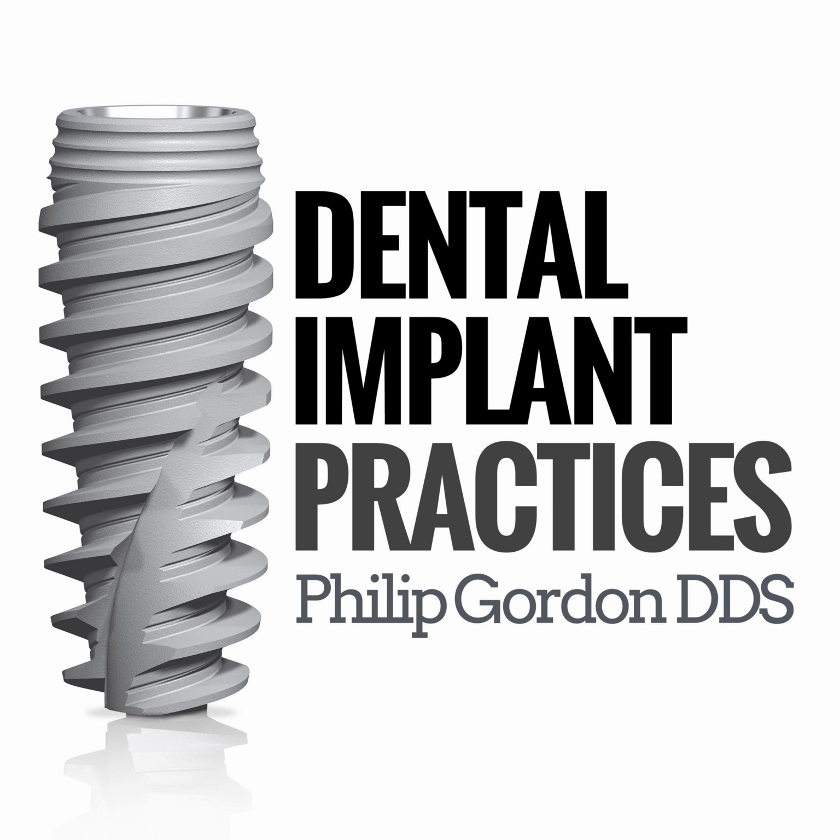What guided implant surgery does is it turns things the other way around. And so what you're doing is you're starting with your final prosthetic plan, which you then bring into the cone beam image. And there's a couple different ways of doing that. So you're basically planning your implant placement and positioning based on the final restoration, whether it's a single tooth or a fixed bridge or even a removable prosthesis or a full arch prosthesis. So it's all completely based on the prosthesis. So you're starting with the end in mind.